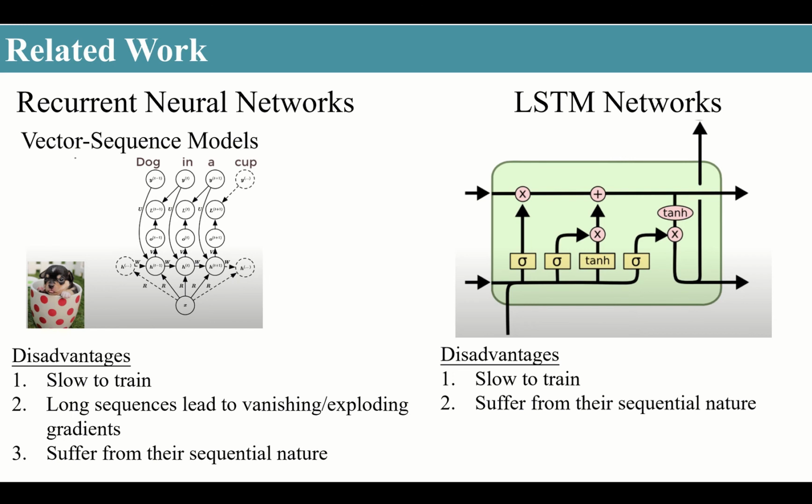The long short-term memory cell has a branch that allows the past information to skip a lot of the processing of the current cell and move on to the next. This allows the memory to be retained for a longer sequence. So in this case, we are able to deal with longer sequences.